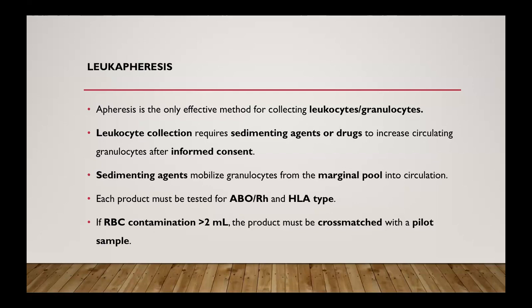So when you are going to collect leukocytes, collecting only circulating ones is not enough. We have to give sedimenting agents in order to pull those that are marginating, and then you can collect them. In fact, we have to give the patient a sedimenting agent in order to mobilize them into blood. Each product must be tested for ABO and Rh, and also human leukocyte antigen type.